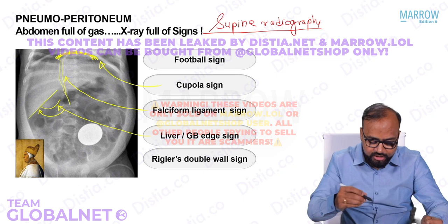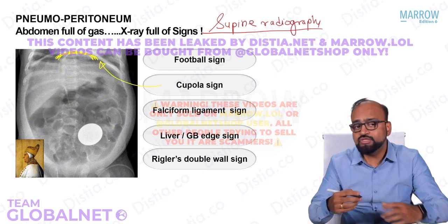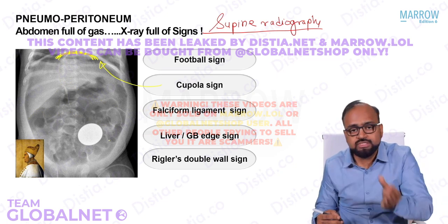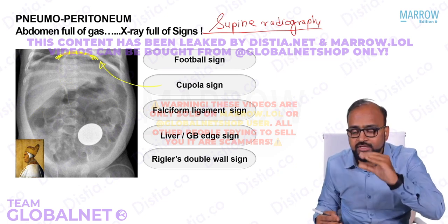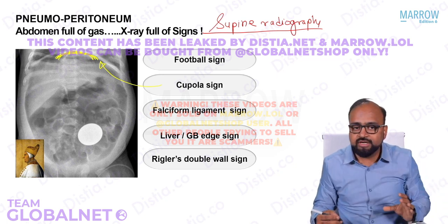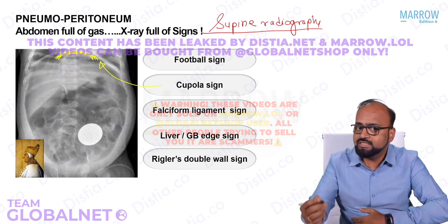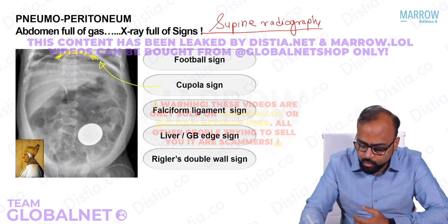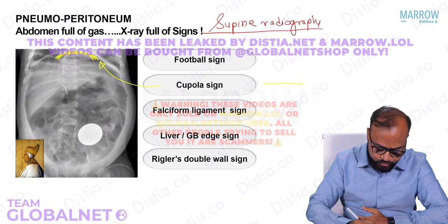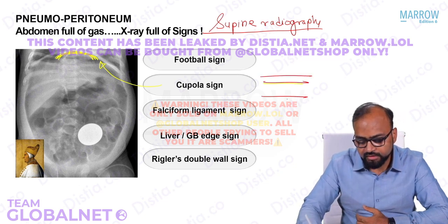Now, watch carefully. Whenever we see a bowel wall, we only see one layer of the bowel, that is the mucosal surface or layer, because air within the bowel lumen lines the bowel wall, and differential radiographic density theory creates that sharp mucosal margin. Why is the serosal margin never seen? See, if this is the bowel wall, like this is the lumen of the bowel.